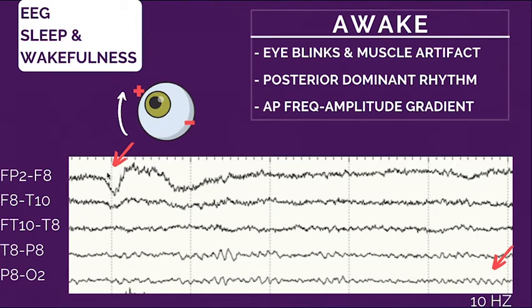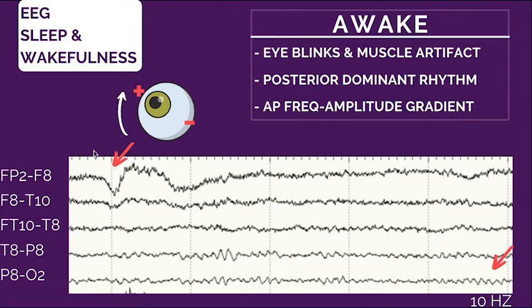Eye blinks appear mostly on the frontal leads because the eyeballs are closer to and placed in the anterior portion of the skull. They're on both sides usually because we have two eyes. So you're going to see these waves on the anterior leads on both sides. And if you pull up the video that comes with the EEG, you can use your cursor to go to that exact second and confirm on the video if the patient is blinking.